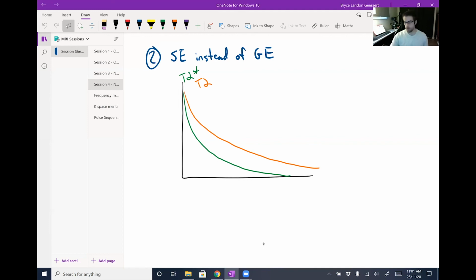That's why when you're doing something like fMRI or DTI, you see kind of higher slice thicknesses than you might in structural imaging, because there's less signal available in those sequences. So you need to have thicker slices in order to actually just collect enough signal to not be looking at a noisy image.